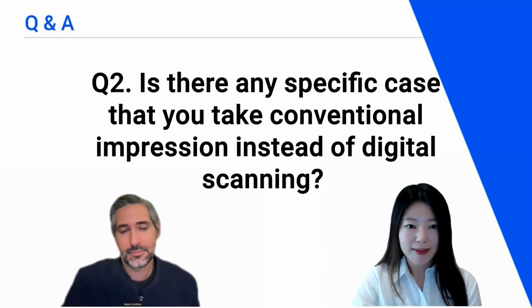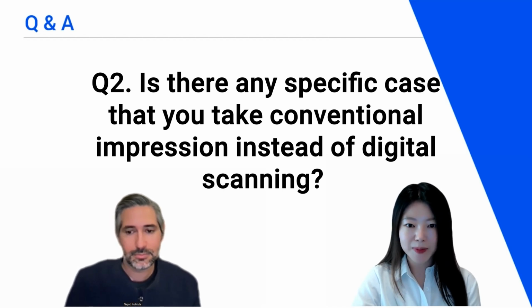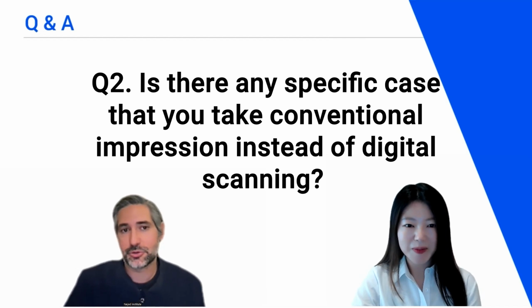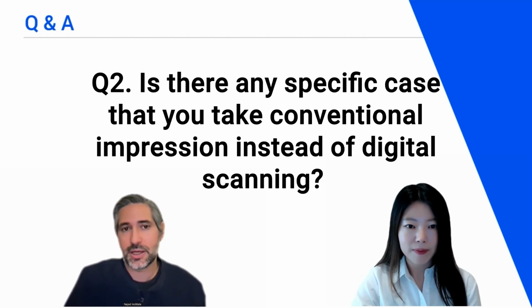Okay, thank you. So question number 2, is there any specific case that you take conventional impression instead of digital scanning? Yes and no. So, okay, let me tell you the story. I started digital scanning in 2014 or 2015. At the time, I was just doing diagnostic scans, never final restorations. I didn't find it to be precise enough.